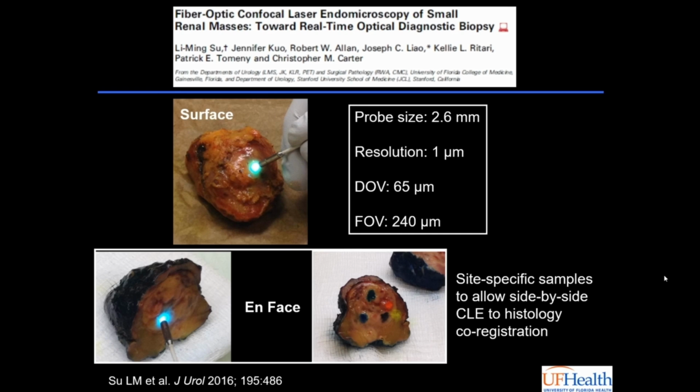And that is because these tumors have a capsule. And these capsules, or pseudocapsules, are thick enough that it did not allow the light excitation to penetrate deep enough to get enough signal back in reflectance to be able to provide an image. So that is the limitation of light imaging technologies. You know, the higher resolution, the more limited the depth of penetration. So that was really the problem that we were facing in utilizing this to derive a contact non-invasive optical biopsy, if you will. But instead, we looked at the en face imaging to say, well, what would it look like if we did penetrate the tumor?